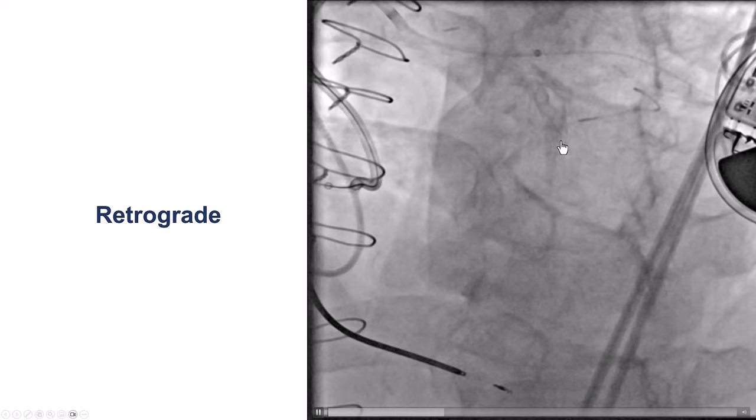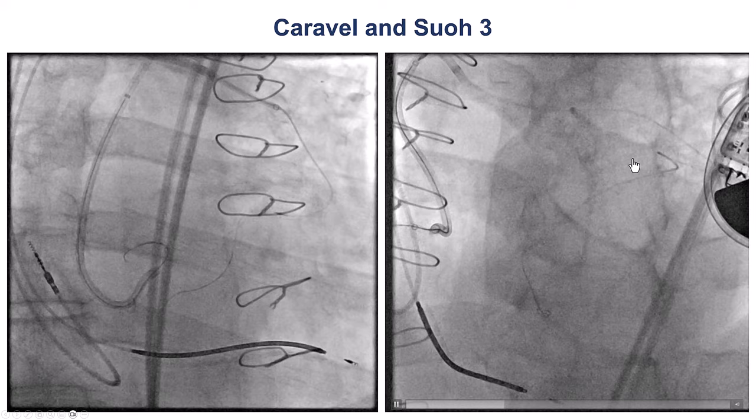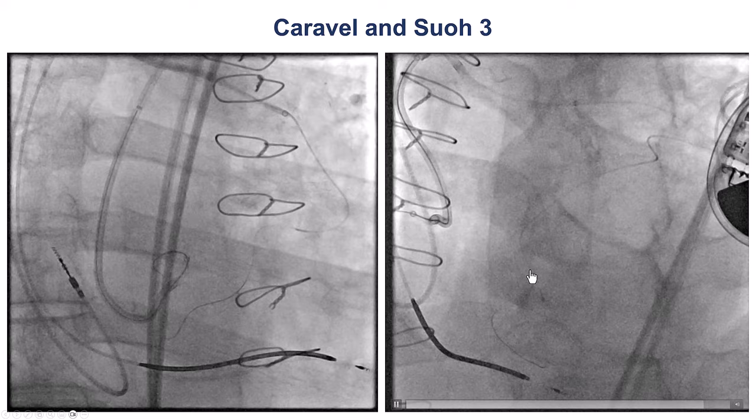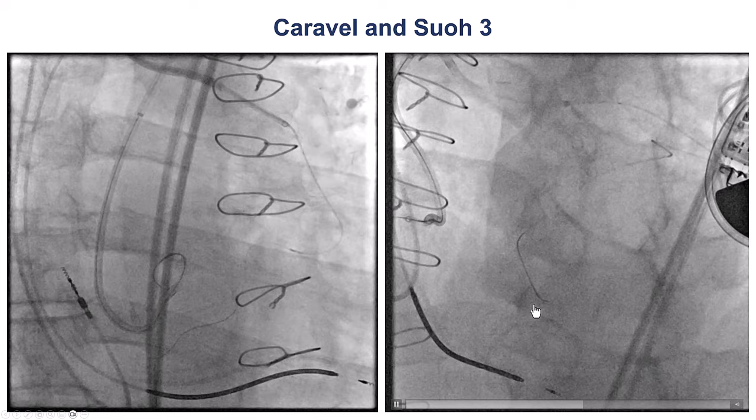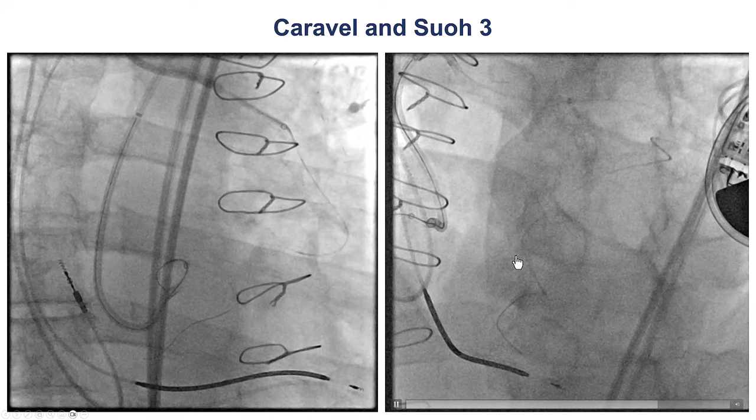We used a microcatheter — this is a Caravel. We can see that there is significant tortuosity in the distal segment of the collateral. We tried to cross retrograde using a Suoh 03 guidewire, which is the guidewire of choice for epicardial collaterals, and we were able to successfully navigate through the tortuosity — the secret being gentle rotation and being patient, as the wire may take some time but eventually follows the course of the vessel.